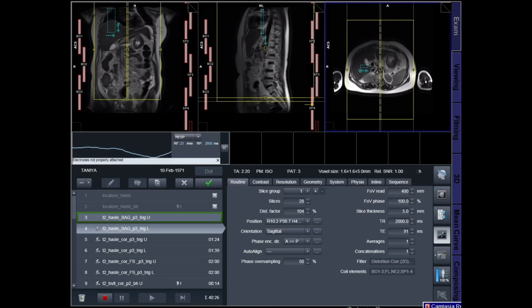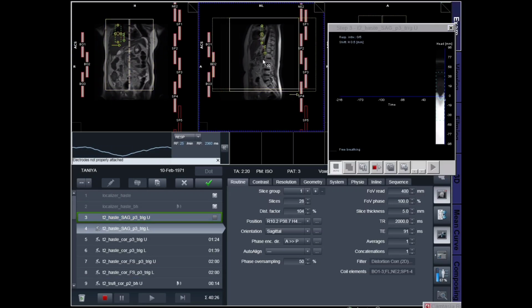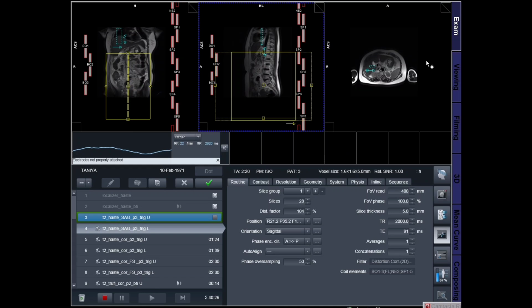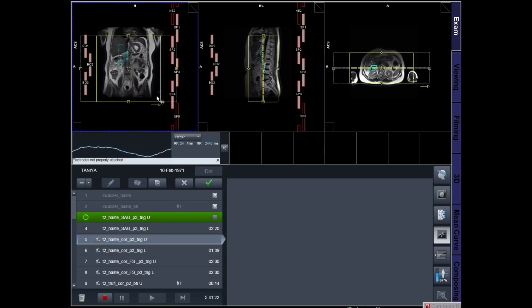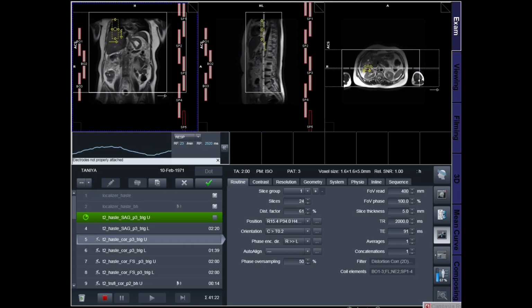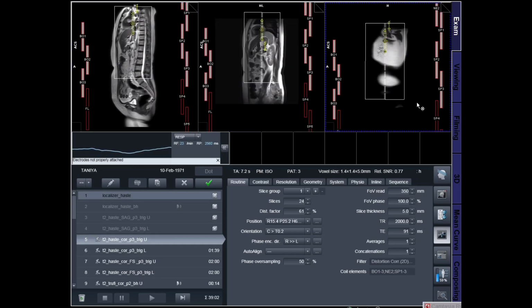Today, we will discuss the MRI of whole abdomen planning protocol. MRI, or magnetic resonance imaging, is an advanced imaging modality used to evaluate abdominal organs, such as the liver, gallbladder, pancreas, spleen, kidneys, adrenal glands, and bowel loops. Whole abdomen MRI is commonly performed to evaluate tumors, inflammation, infection, congenital anomalies, and unexplained abdominal pain.